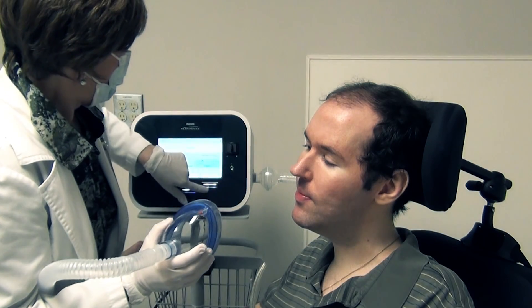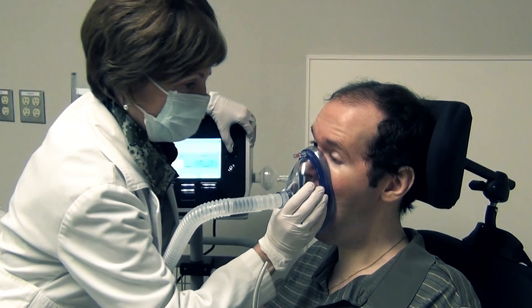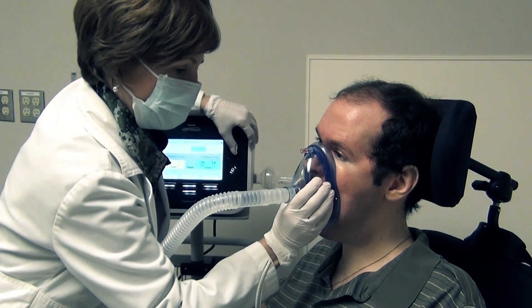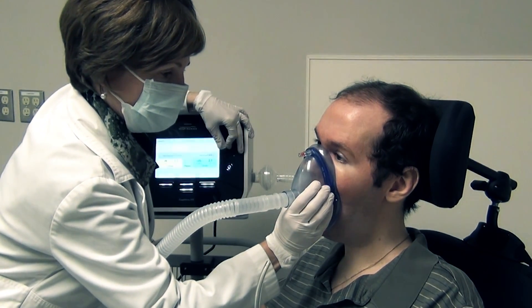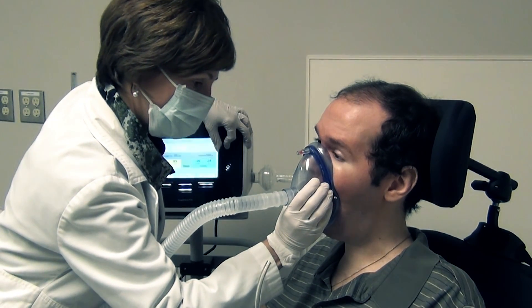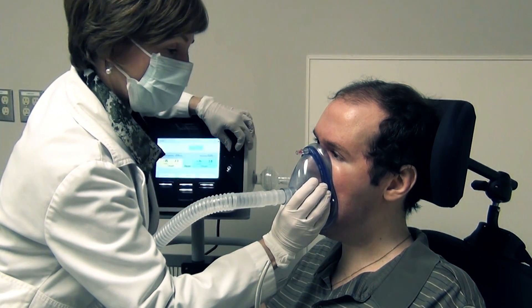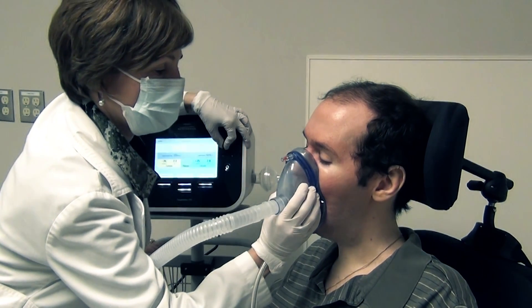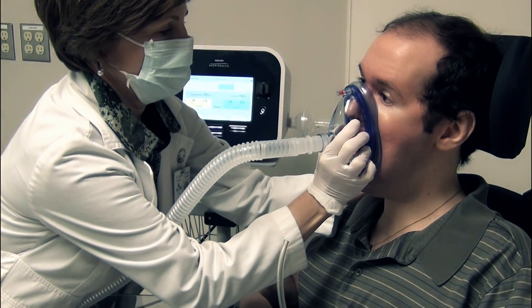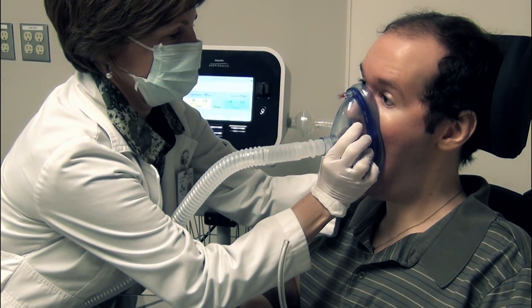Mechanical Insufflation Exsufflation. The ability to cough is essential to life. The mechanical insufflation exsufflation device, known as the MIE, simulates a cough and allows for non-invasive airway clearance. The MIE is recommended for individuals with neuromuscular diseases, spinal cord injury, or musculoskeletal conditions who are unable to achieve an effective cough with lung volume recruitment and/or manually assisted cough.